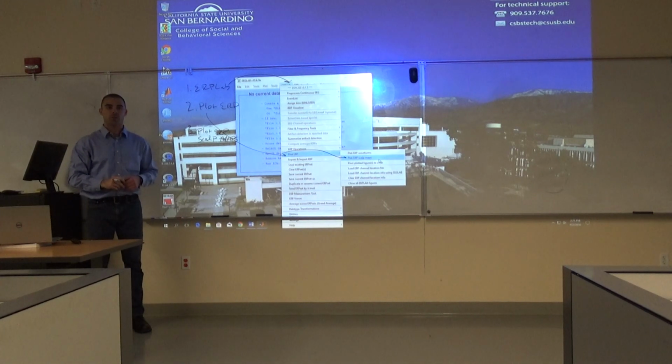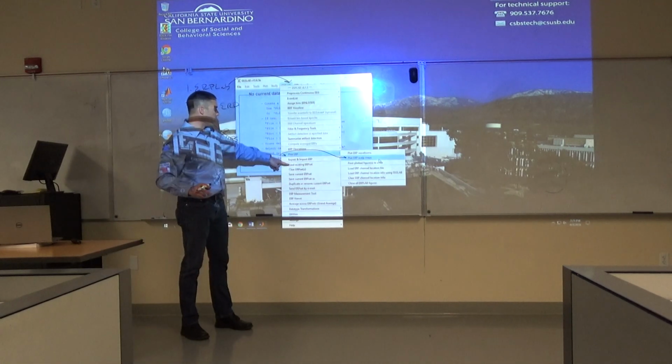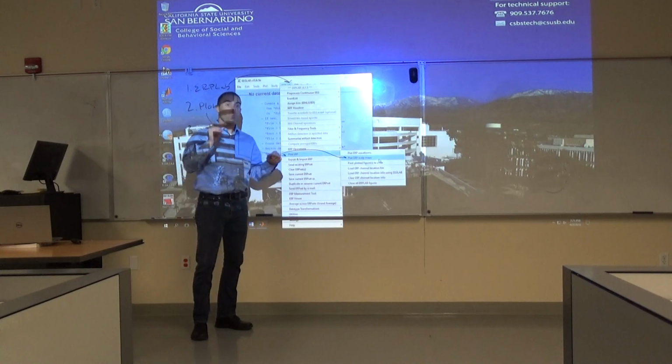Did you import, I missed how you imported, did you import the data? Yeah, so to import, you're going to do ERP Lab, and you're going to do load existing ERP set. Load existing ERP set, okay. And then after that, you're right.